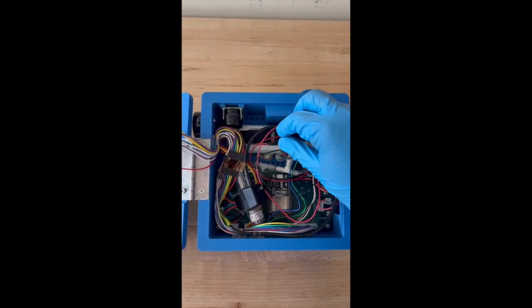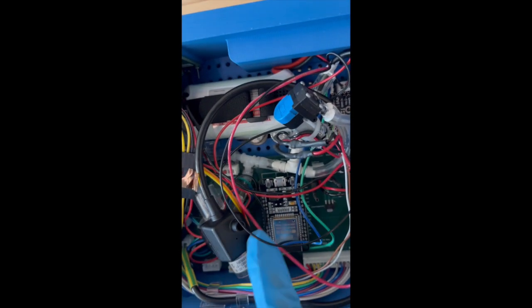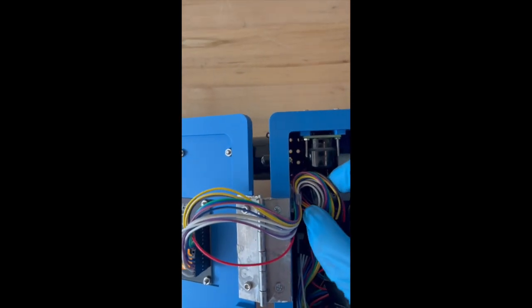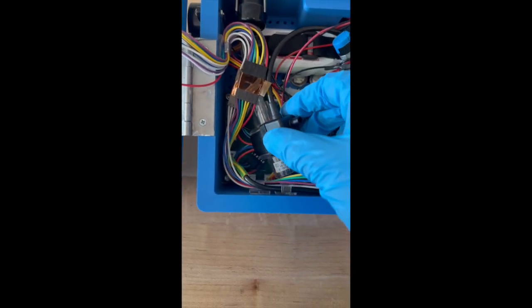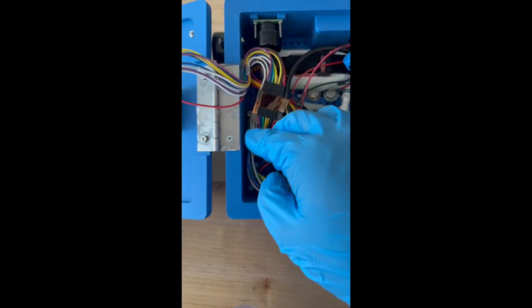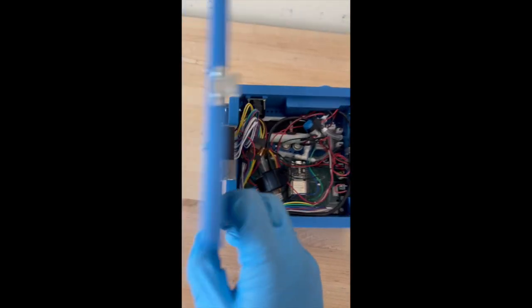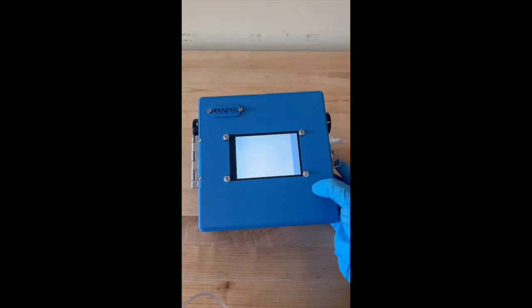After this relative humidity and temperature sensor, we are then going to the pressure sensor, the absolute pressure sensor, so we can do pressure compensation and enable more accurate readings of CO2 accordingly to higher pressure in the line or different altitude levels. Then we go to the actual CO2 sensor, which works through non-dispersive IR sensing, and finally the flow sensor, which enables us to tell if the sample line is blocked. And this wire that I just ran my hands through goes to the screen and enables us to display the capnographic waveforms, all the alarms, and have touchscreen enabled for the users to be able to use.